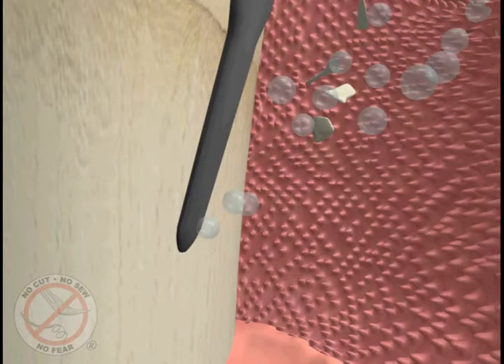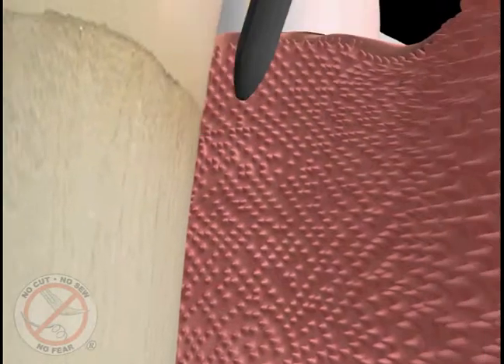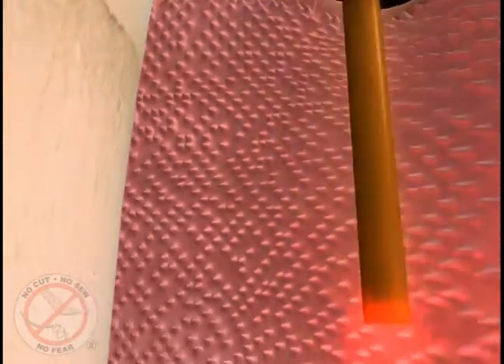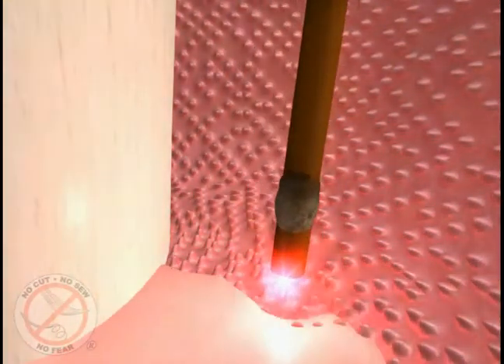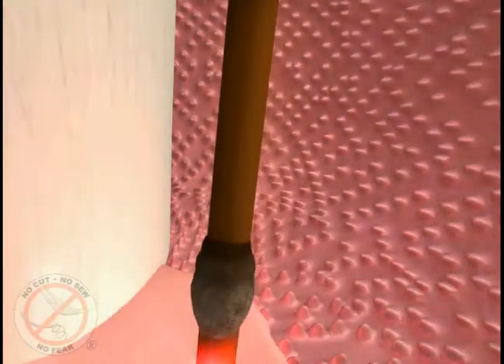Some hand-cleaning instruments may be used at this time to remove any remaining hard calcium deposits. Then the laser is used again at the bottom of the pocket to remove any remaining diseased tissue. This pass of the laser also sterilizes the tissue and bone and completely eliminates the bad bacteria, germs, and toxins.